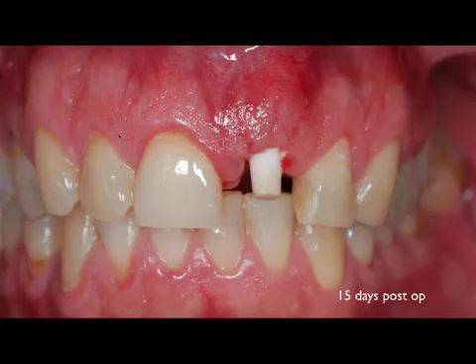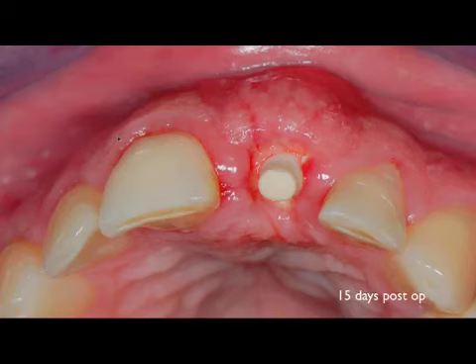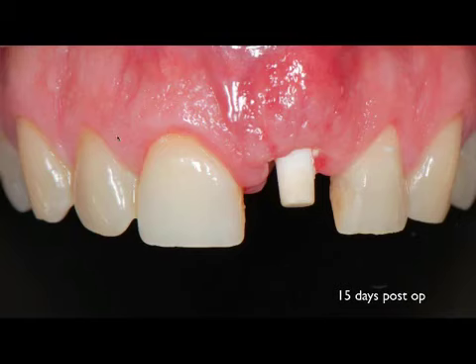This is after healing, and we see how the soft tissue migrated coronally, and we have a nice soft tissue profile to start our restorative phase. That's the close-up. Again, this looks like a tooth preparation, be it an aggressive preparation, but it is.